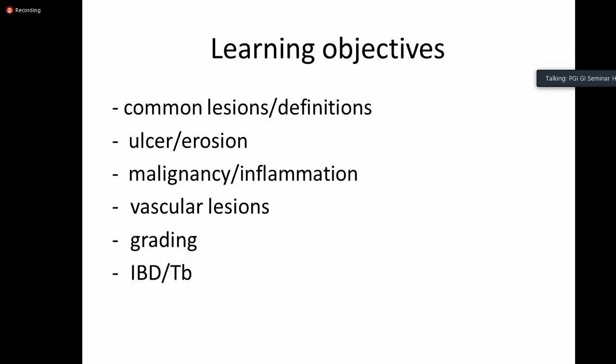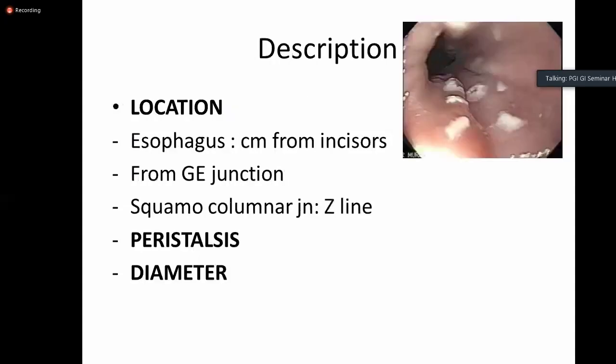And if time permits, I'll talk about inflammatory bowel disease reporting and the endoscopy of tuberculosis with relation to inflammatory bowel disease.